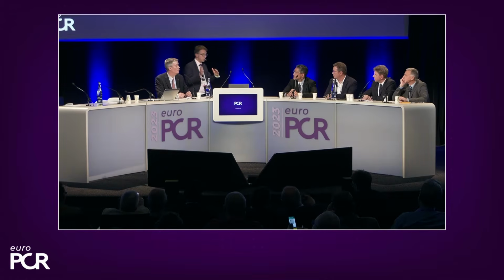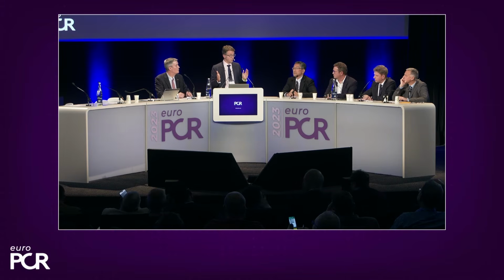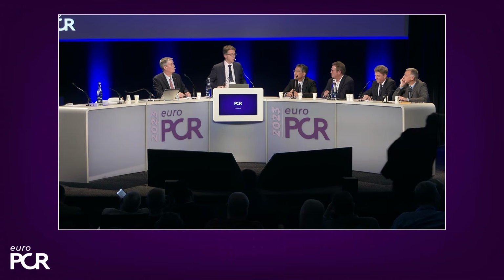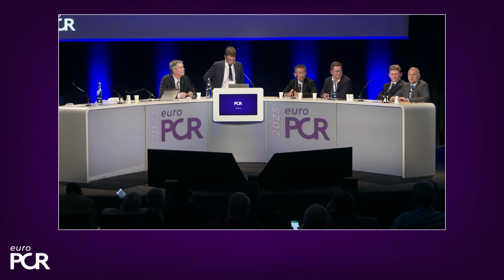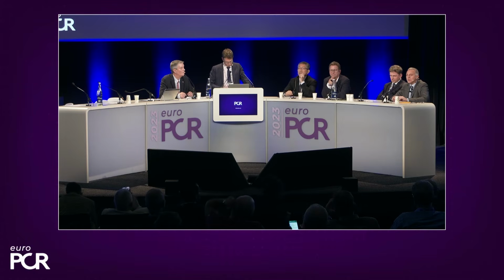Other questions? And then questions around really how to undertake the kissing. Jens, I wonder if you want to answer that in terms of how you size side branch, main vessel, circumflex and LAD, whether you use non-compliant or semi-compliant. Is it different for provisional or 2 stent? Sorry, that's a lot of questions, but technically, how would you approach the kissing? It would help also if you would draw some of it. So the selection of the size of the balloons for kissing balloon inflation should have a rule for the main vessel.